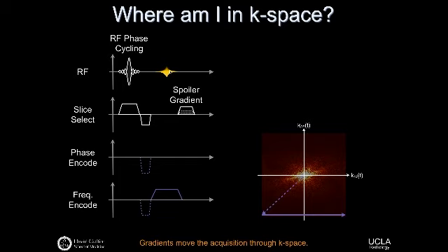It's also radio frequency. It's very, very high frequency at the Larmor frequency. And in this case, we can form a gradient echo through the reversal of a gradient. We form a gradient echo. We need a 180 pulse to form a spin echo. And that echo will be used to fill a single line of K-space. And then again, after having acquired many, many lines of K-space, we have all of the K-space to subsequently Fourier transform and form the image that we actually care about.